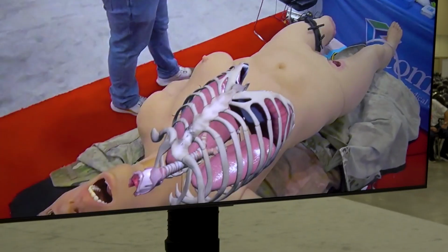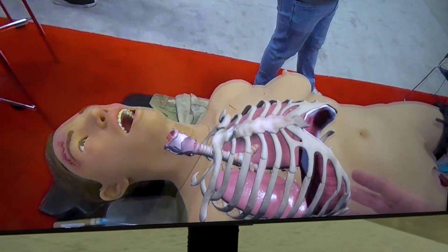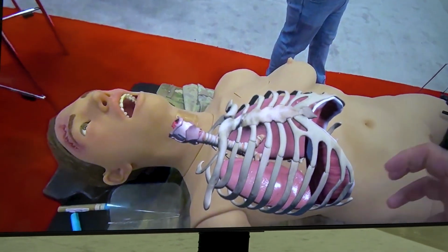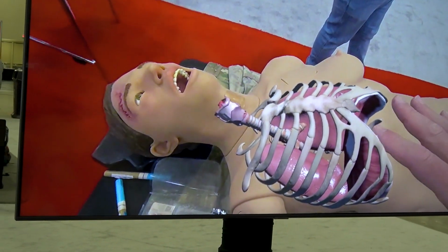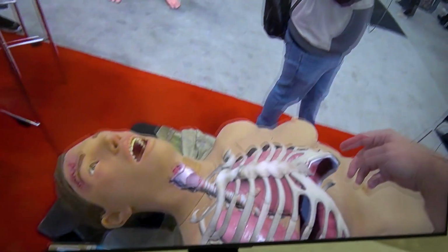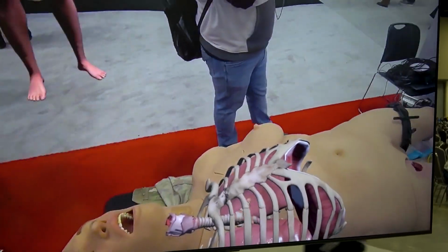So what a pneumothorax does is somehow, like maybe through a penetrating injury, air has entered the cavity of the chest, and that has created pressure, and that pressure has caused the lung to deflate. And that means that there's only movement on the left side, the right side is immobile, so we need to relieve that pressure, and the way you do that is with a needle D.